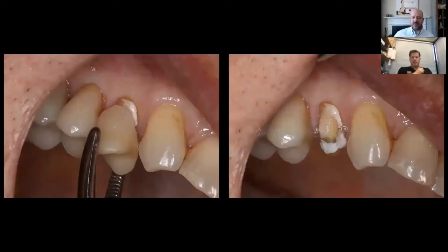So here we're getting off the temporary, and we can see in a minute — it's a beautiful prep and the gingival looks great. What is very common when we get these temps off in a lot of cases is the residual cement. What kind of cement did you use in a case like this? This is a vital tooth, and any tricks for getting that off? Because we're going to be talking about resin cement and we don't want to tear up that gingiva and have marginal bleeding, which could make bonding more difficult.